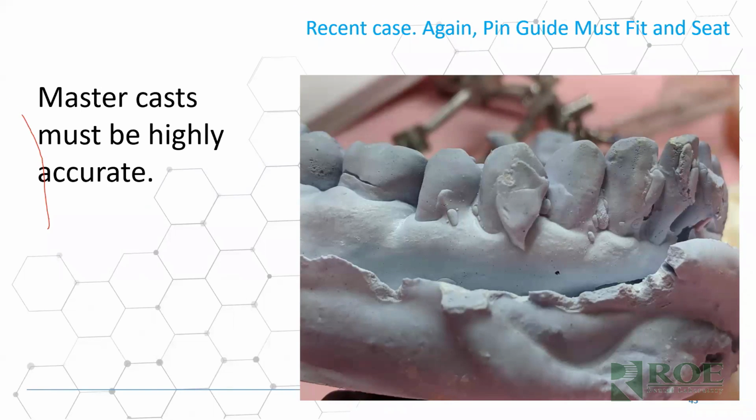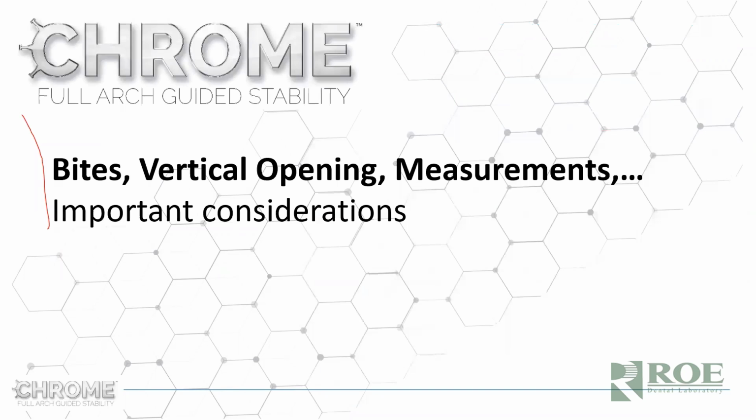Some pulls, some drags, some bubbles, some voids, some of those things can be overcome. But if there is distortion, in a case like this, please retake. It's good to catch at the office before it comes into the laboratory, because we'll definitely give you a call. If it's not perfect, we want your success to be part of good record taking.